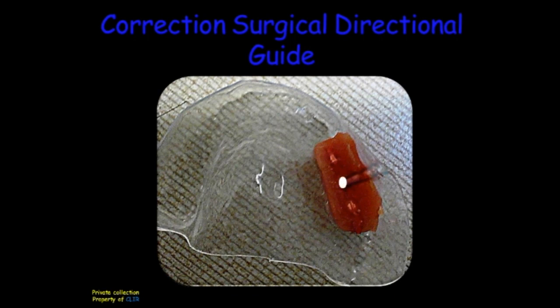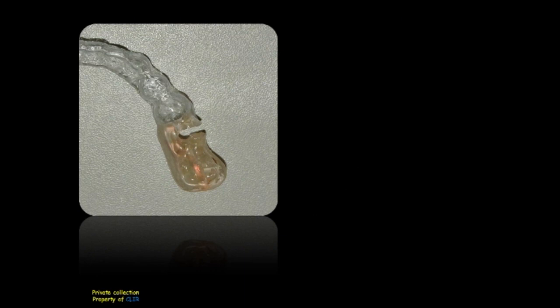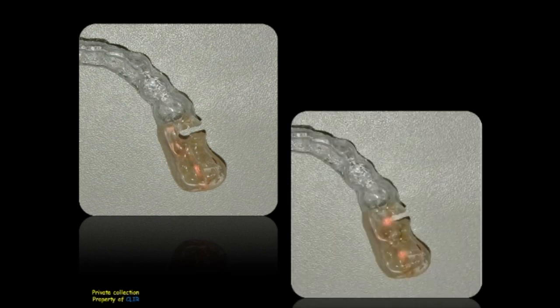Instead of cutting the buccal tunnel till the gutta percha points, we'll cut it till the green point, which means 2 millimeters less buccally. In this slide, we can easily see the difference between a full tunnel till the gutta percha points and another one 2 millimeters less buccally.